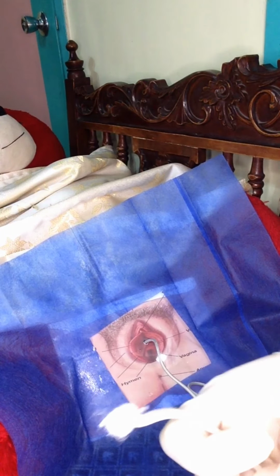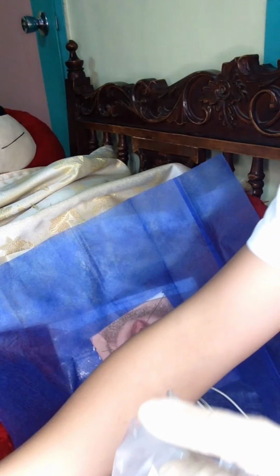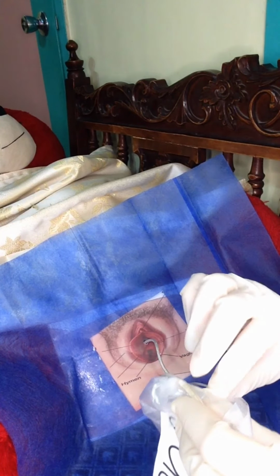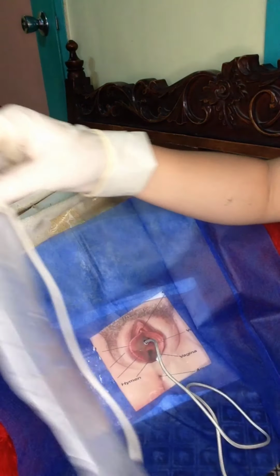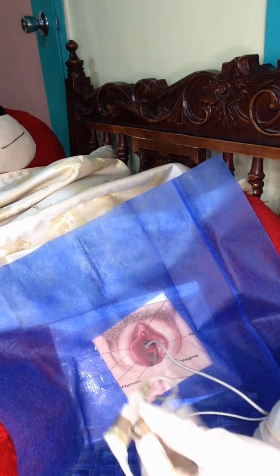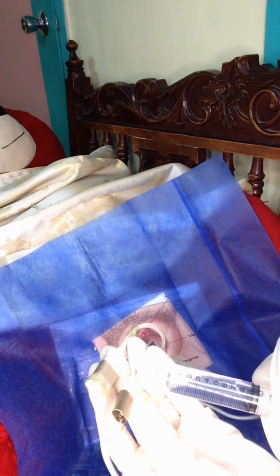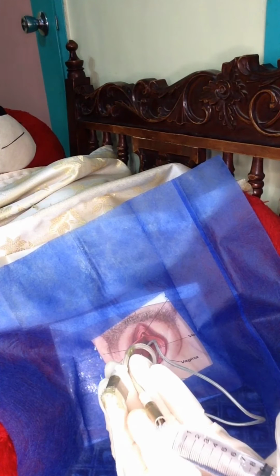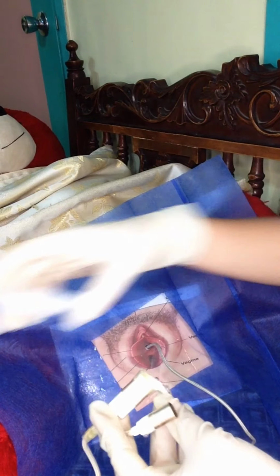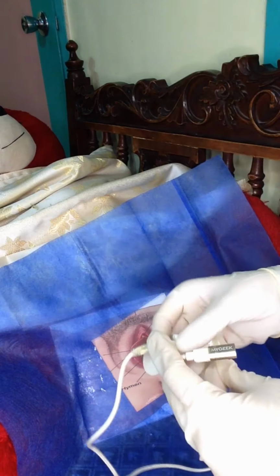So we will connect our catheter with the urine bag. Then we will inflate our catheter balloon inside the bladder. So assuming that the balloon inside the bladder is inflated.